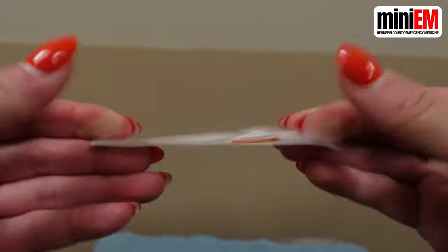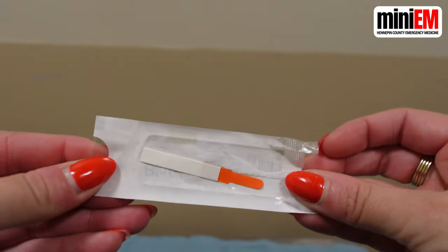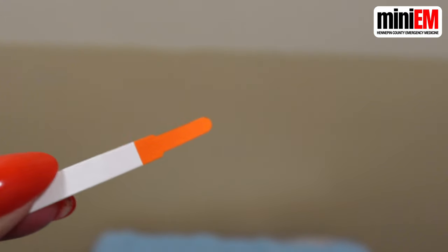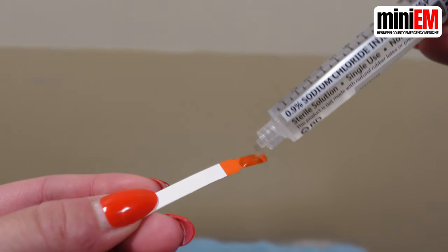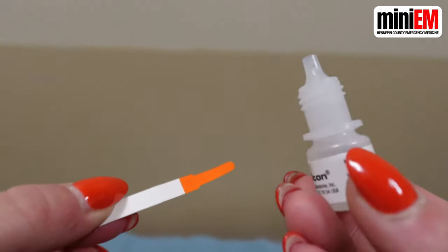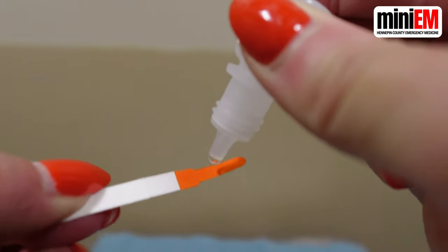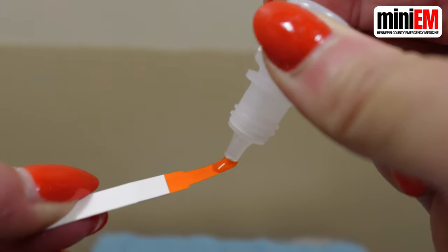You'll want to make sure that your fluorescein strip is wet before you touch it to the patient's eye, or else it's just going to stick and be uncomfortable. So you can either take one drop from a saline flush or you can just use one of your anesthetic drops onto it.